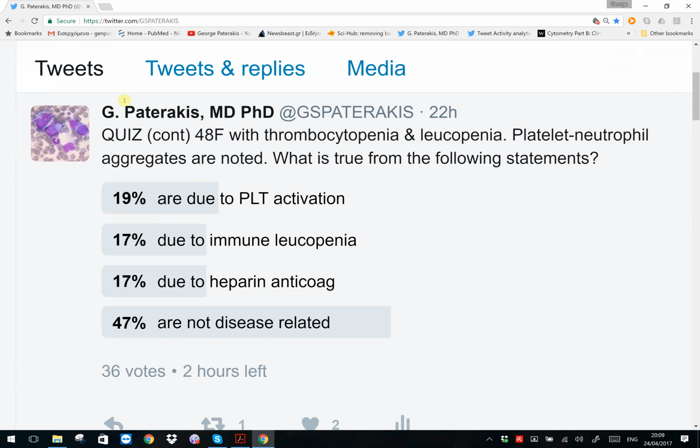Is there platelet activation? And we have platelets around neutrophils. Do we have immune leukopenia here from any reason with this whole picture of platelets around neutrophils? Is this attributed to heparin as an anticoagulant? Or is all this phenomenon not disease related? So we have all these options. We have not given a title to this phenomenon of platelets aggregated around neutrophils. So what is this phenomenon?